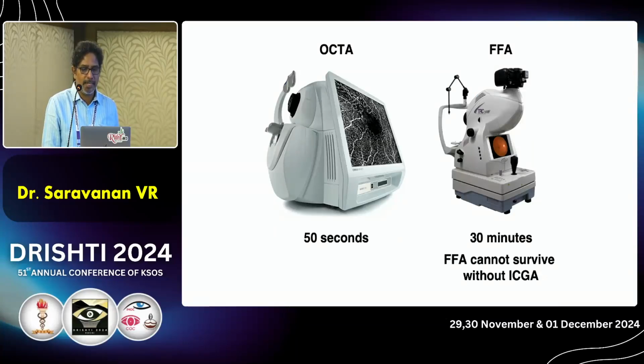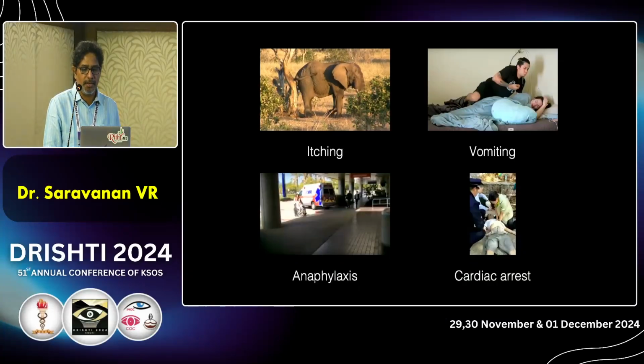Recently, with the introduction of both optical coherence tomography and OCT angiography, because they are non-invasive and very easily capturable images, the question arises whether we still need this in today's time when we are mostly avoiding all this.